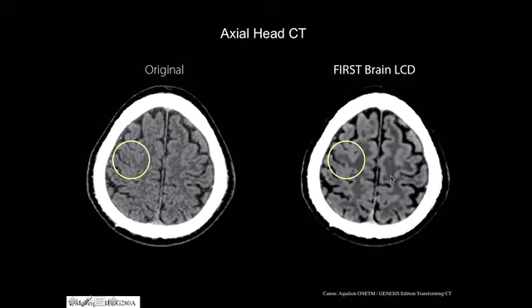So these are white matter tracks, this dark stuff, and this stuff here is gray matter in the cortex. This very bright signal here is the bone of the skull, and bone stops X-rays very well, so it shows up very bright on these scans. The dark signal back here is cerebral spinal fluid. It's like pure water, and then there's air on the outside, which gives a very low signal.